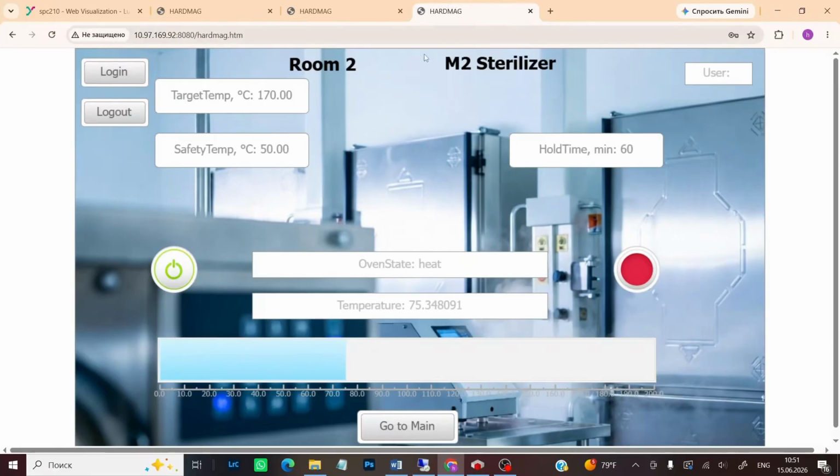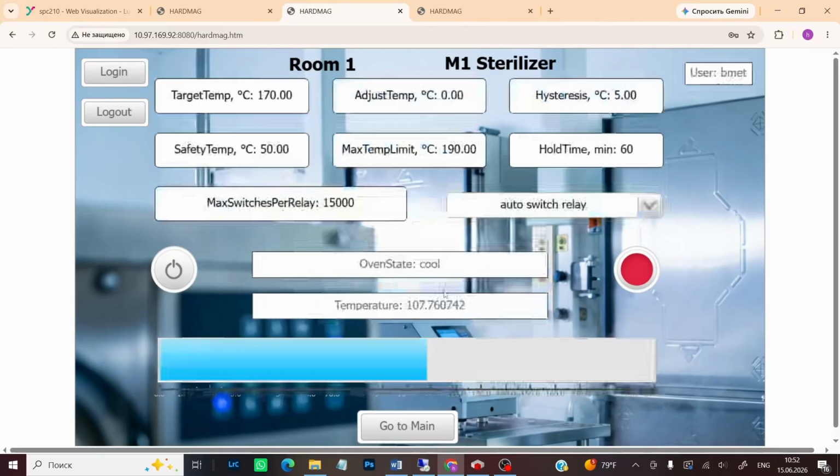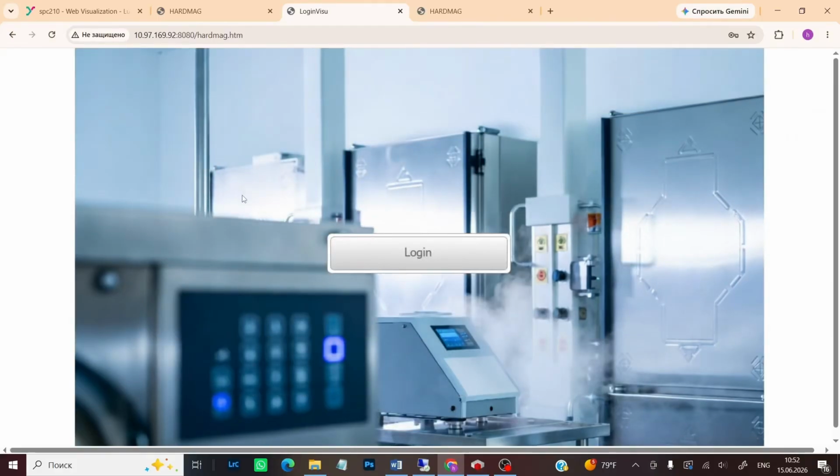After 1 minute, the nurse and BME users will be automatically logged out. They will remain on the current page, but without the right to control the automated system. When they log in again, they will immediately return to the page they were on before the lockout event. And if you need to go back to the main page, just click the Logout button and you'll be taken to the main page, where all unauthorized users land when a browser client first connects to the PLC.